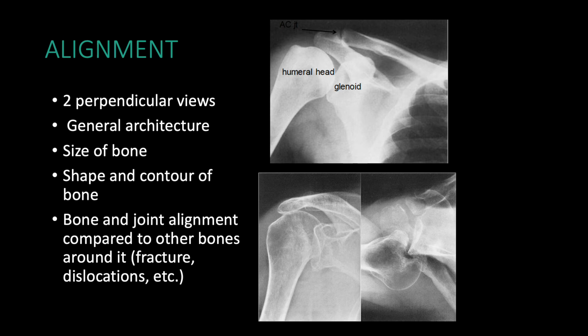And then we look here and you see the humeral head sitting in front of the glenoid with that Hill-Sachs lesion. So really we want to look at all these views, look at your alignment, the bone density, cartilage spaces. In fact here, you see an overlap, so you know something's going on with the cartilage. And then soft tissues, because we're kind of cut out on this view, but you see the soft tissues here, you don't see anything really major at this point.